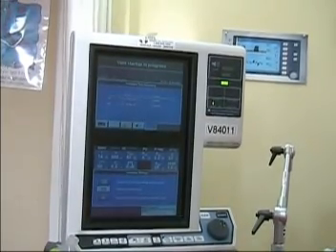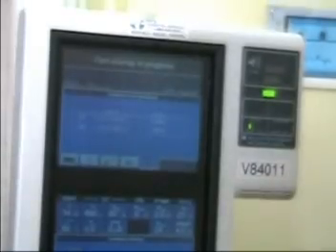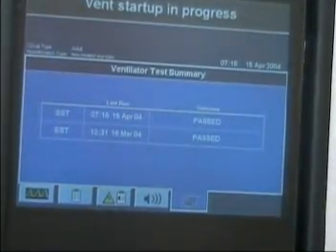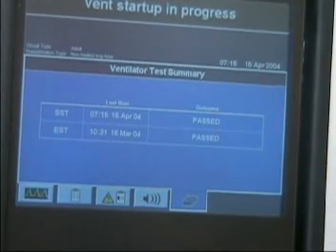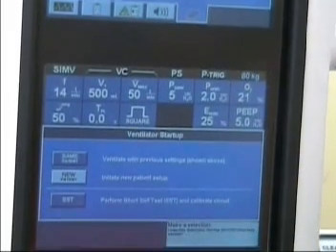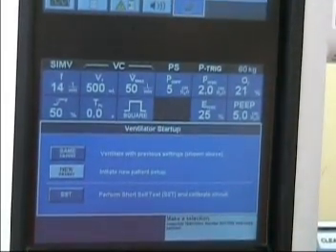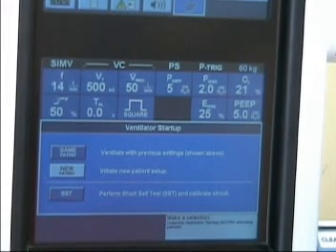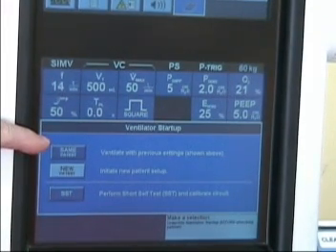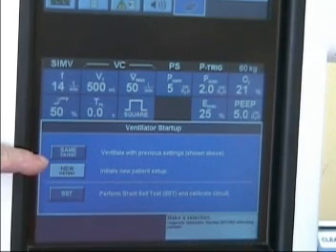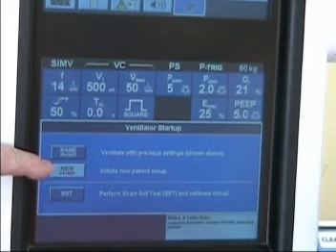This is the main start-up screen you'll see at the top. It will tell us the last SST, which was just today. And then below, these are the previous ventilator settings. If we're going back on the same patient, we would touch the top box — same patient.